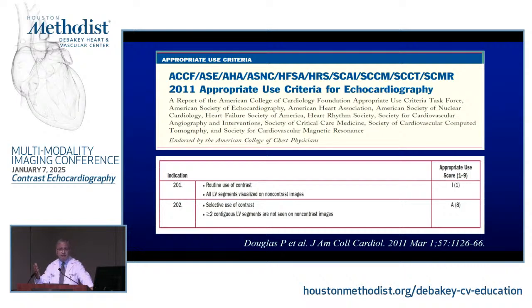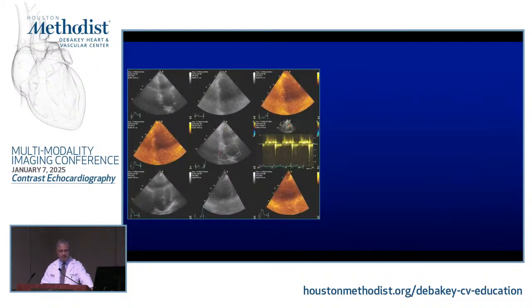A big ventricle, question of a thrombus, or wall motion is not well seen. So gradually you'll get to a comfort zone where more and more appropriate use of contrast would be. I don't think there would be any controversy here from seeing this collage of the same patient that you tell me whether the ventricle is normal, yes or no, whatever you can say.